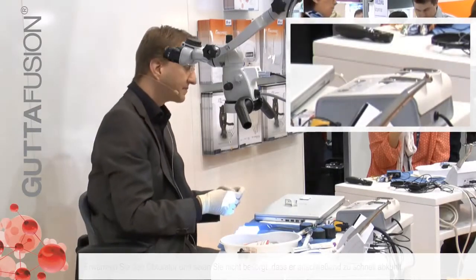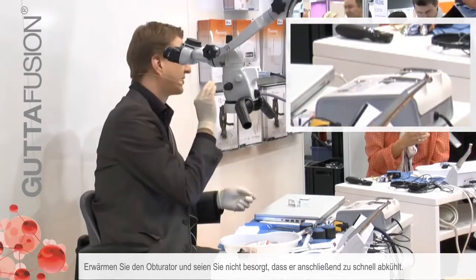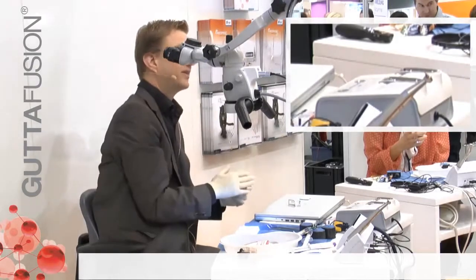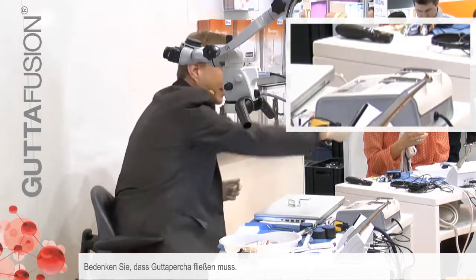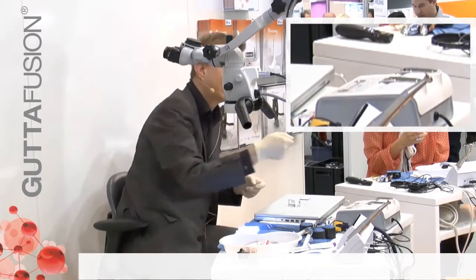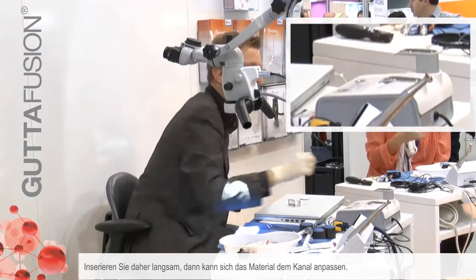It takes a minute, and don't be afraid that it will cool off too quickly — we have all the time. With students, they were always anxious that it would cool down, so they inserted it very fast — like stabbing. But it's a warm material that needs to flow somewhere, so it's important to insert it really slowly. If we do so, we allow the material to actually adapt the way that we want it.